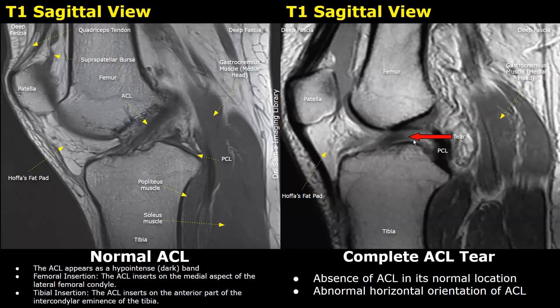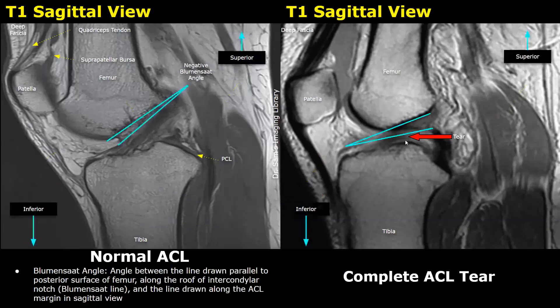The image on the right shows a complete ACL tear. In this case, we do not see the normal fibrous slanting band in sagittal plane — it is absent. There is absence of the ACL in its normal location. It is present down here in a horizontal orientation, and this appearance suggests a complete ACL tear.